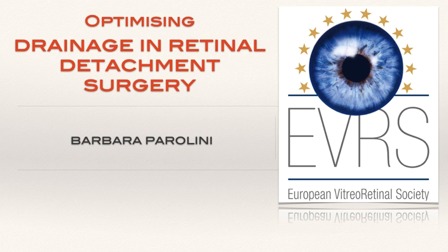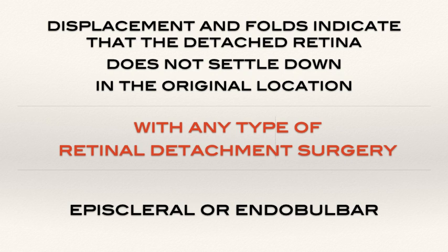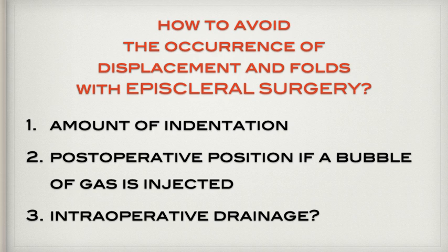I will present my thoughts on how to optimize drainage in retinal detachment surgery in order to avoid retinal folds and displacement. Displacement and folds indicate that the detached retina does not settle down in the original location. It might occur with any type of surgery, either episcleral or endobulbar.